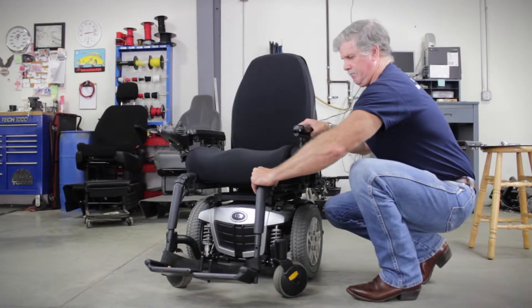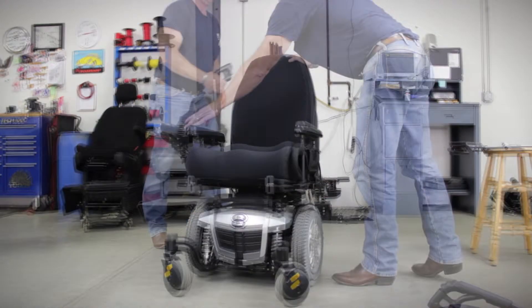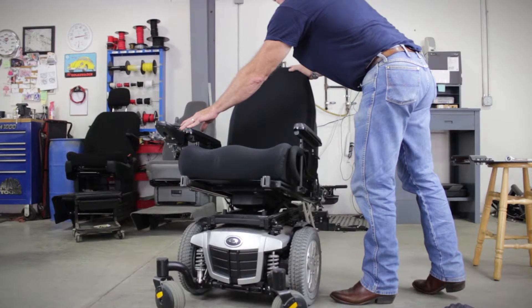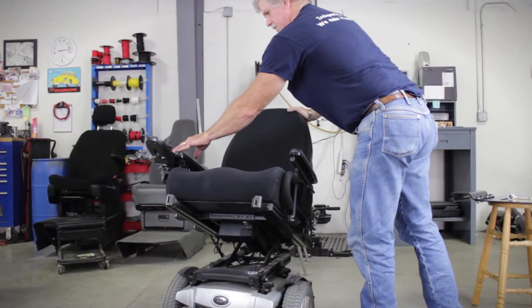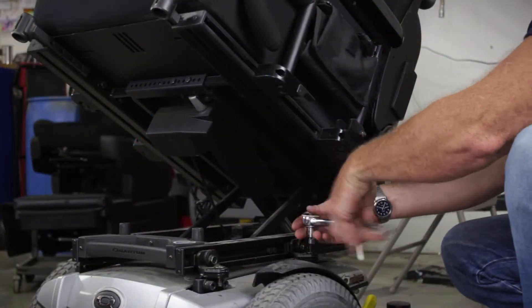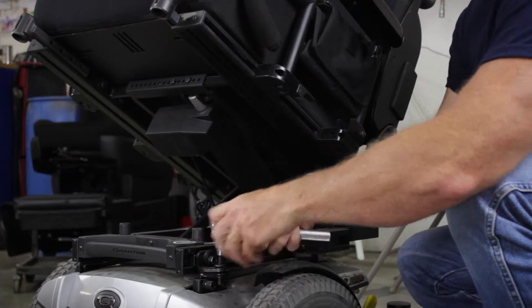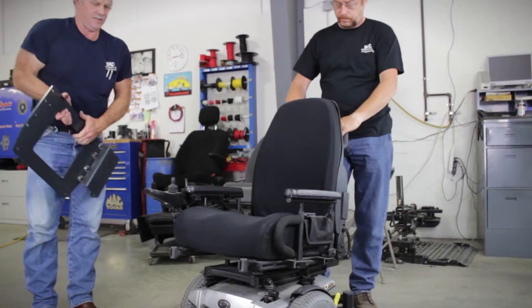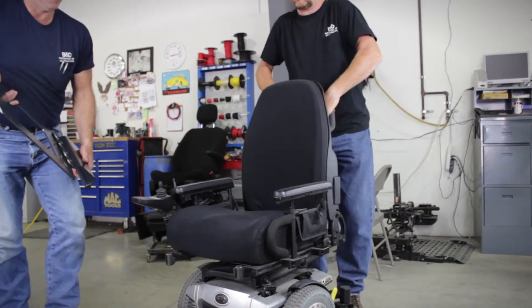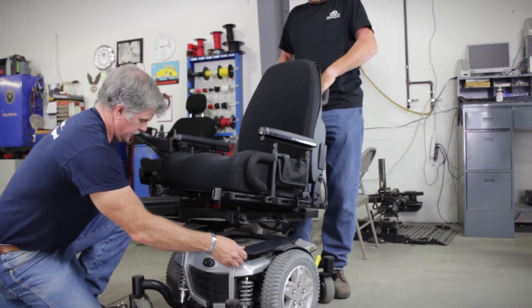Begin by removing the legs from the wheelchair. Next, stage the seat so that you can easily reach the bolts that hold the seat and the frame together. Remove the seat frame from the base of the wheelchair — this will vary between the models of wheelchairs available. With the assistance of another person, lift the seat frame from the base of the wheelchair and apply the frame brackets.